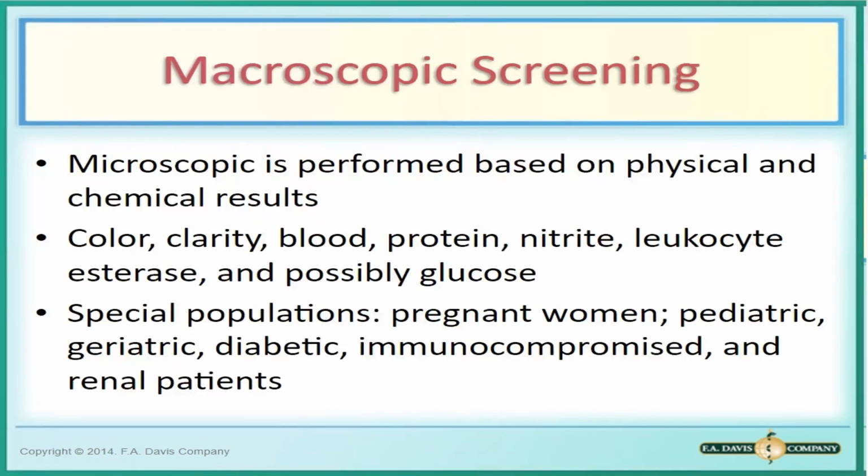Bakit siya sinabing least standardized? We have what we call macroscopic screening or chemical sieving. This one is done to maximize time. Paano pong ginagawa? If your physical and chemical examination is normal, no need to proceed po for the microscopic examination. However, in special populations, the pregnant women, pediatric, geriatric, diabetic, immunocompromised, and renal patients, or if requested by the physician, regardless of the result ng chemical and physical, mag-move forward ka pa rin sa microscopic examination.